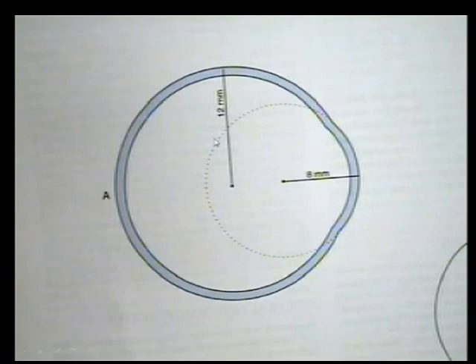Radii of curvature are important with contact lenses, and this gives you an idea of the effects of a longer radius giving you a flatter curve, and a shorter radius giving you a steeper curve. In this case, the shorter radius represents the cornea, and the longer radius represents the sclera. The only flaw in this diagram is it shows the cornea being spherical edge to edge, when in reality the cornea is more aspheric, steeper in the center and getting flatter, almost assuming the radius of the sclera as you approach the limbus.